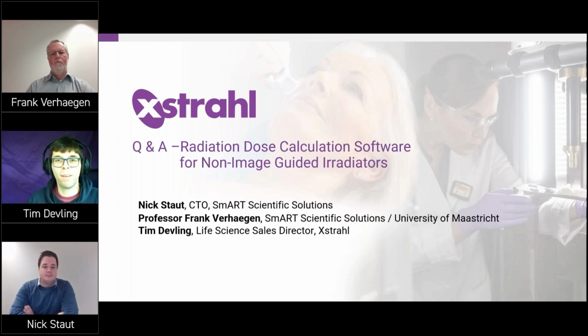So now we're getting into the devil in the detail. You might guess who some of these questions are coming from, but which detectors were used for the PDD measurements in the different materials? EBT3 film. So film-based. Yeah. And we also had the ion chamber measurements for the air kerma, obviously. Okay, and what solid water did you use? Plastic Water LR was the solid water, and the bone material was RB2.